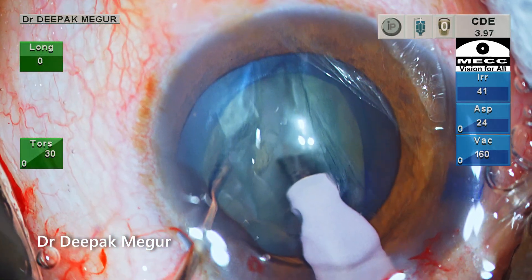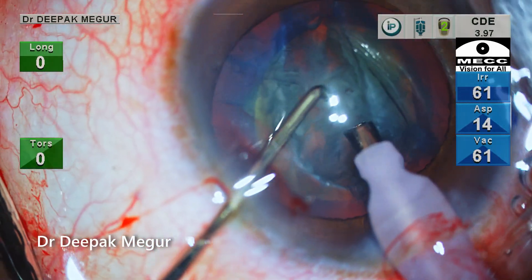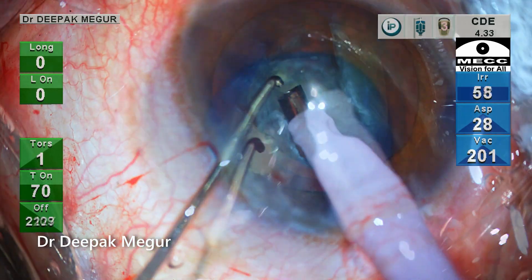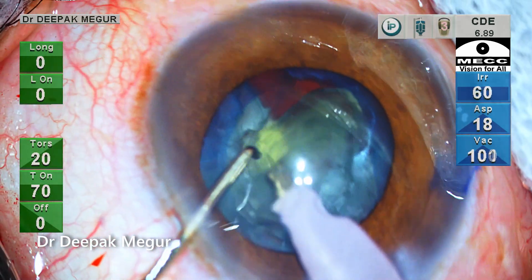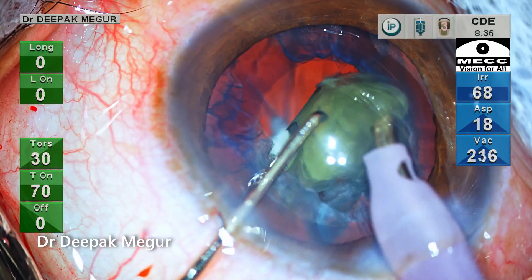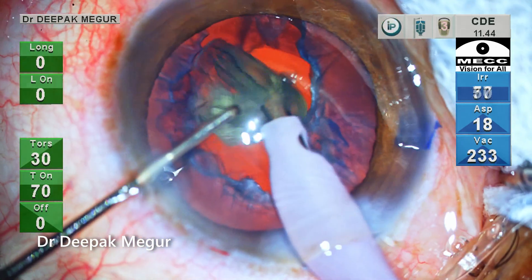The trench is deepened and the nucleus is divided into two halves. Chopping is difficult as the nucleus is soft. The bottle height continues to be low. By using very low power, the fragment is finally engaged and pulled out of the bag and then emulsified quite easily. The second heminucleus is similarly pulled out of the bag and aspirated quite easily.